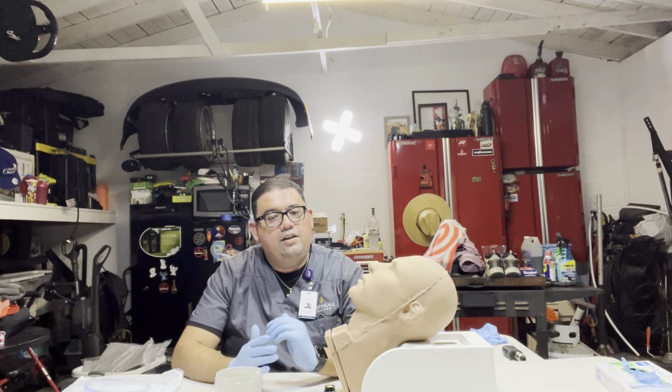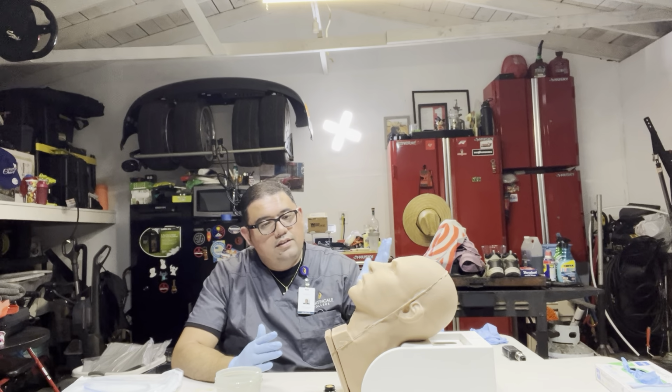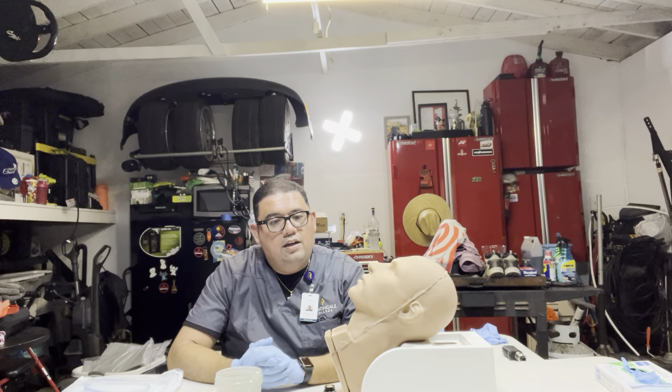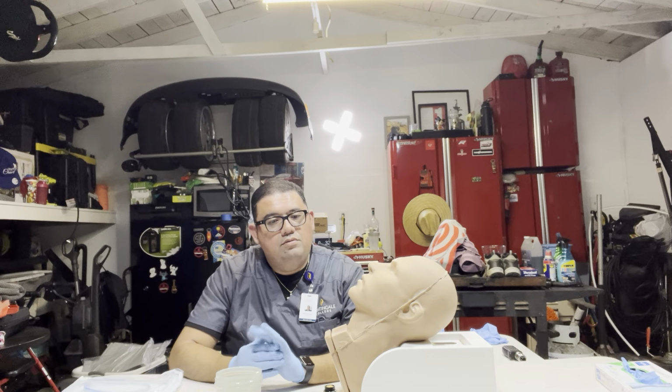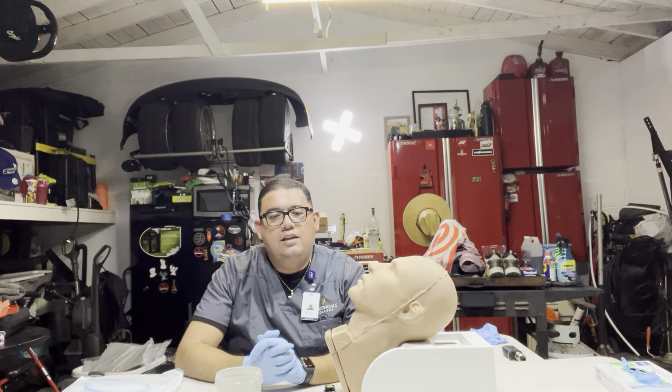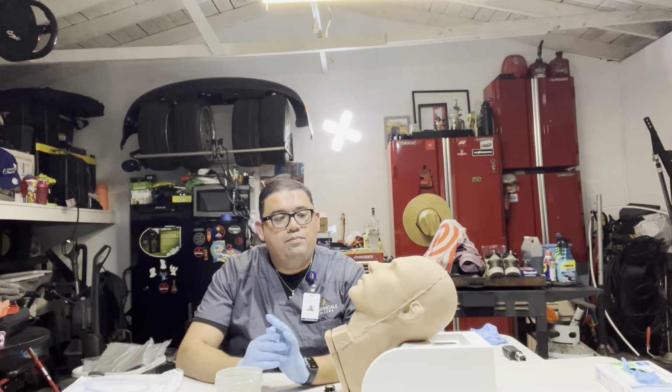Okay, I'm gonna go ahead and raise your head in the bed. Is that okay? Perfect, thank you. And then I'm gonna go ahead and provide privacy. I'm gonna close the door if needed. And then I'm gonna go ahead now and assess the patient's nares.